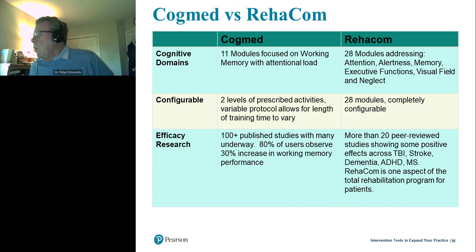But early on, the clinical neuropsychologist I was speaking to in Germany was saying, our goal is not to say, does it work for the average patient, or even to say that it works for the majority of rehab patients. Rather, what we can do instead is say, we can configure the program to the needs of the individual patient and provide that to them using the algorithm that's built into the program to adjust.